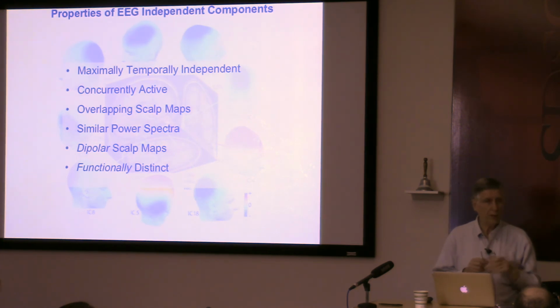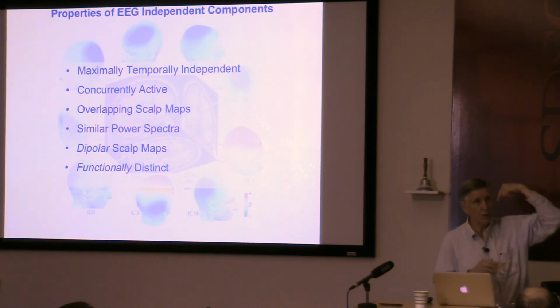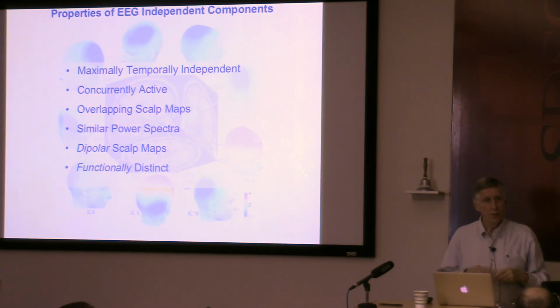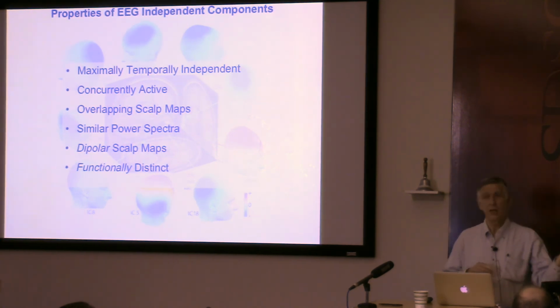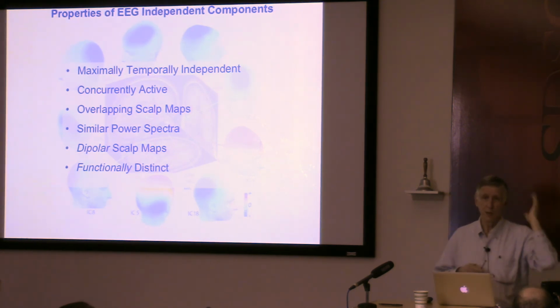waveform. And then when we looked at just the simple amplitudes and latencies of peaks in the ERPs at the source level, rather than at the channel level, we found distinct clusters of sources with distinct and strong statistical relationships with positive symptom scores, negative symptom scores, ability to care for oneself, working memory, visual attention, et cetera, et cetera.